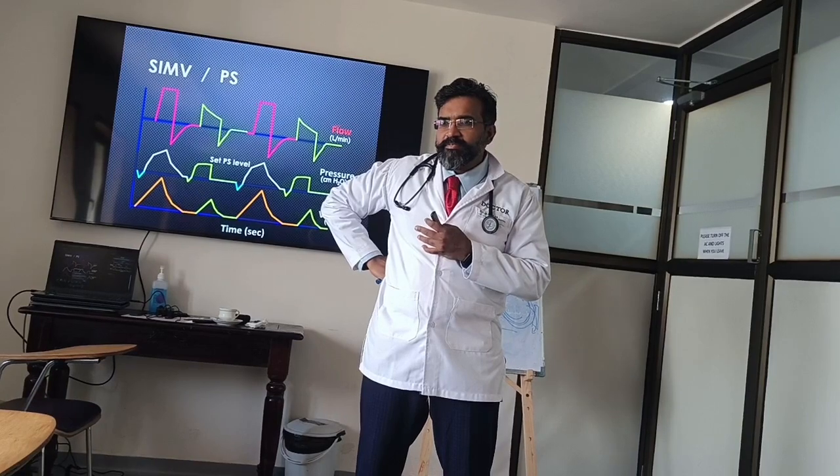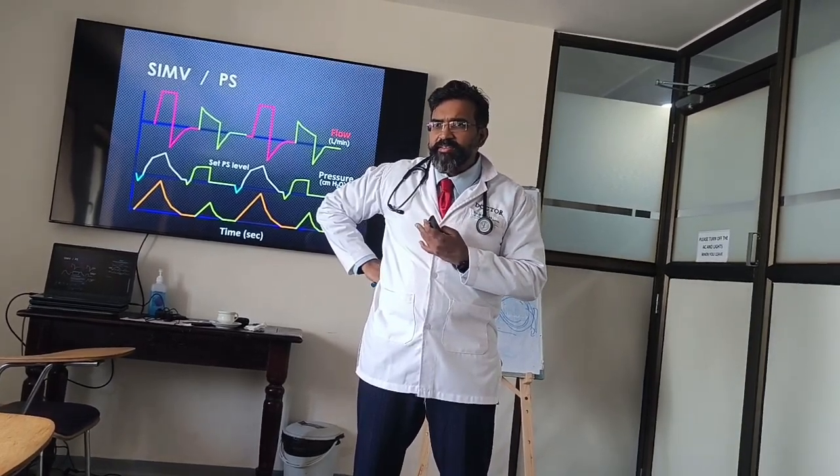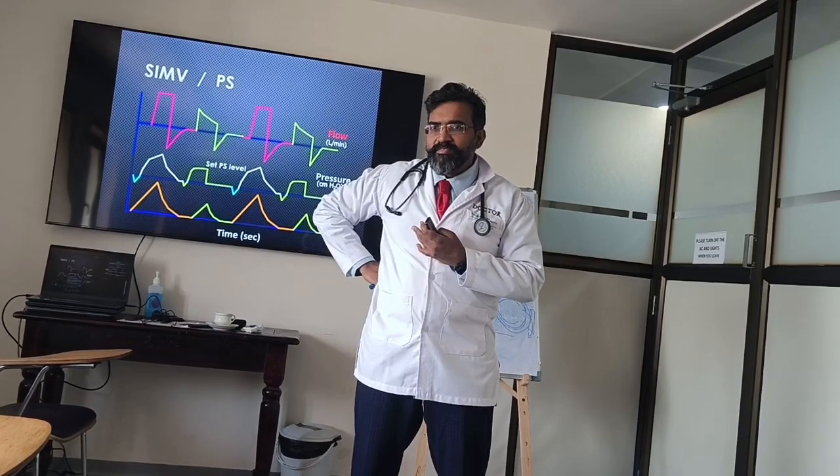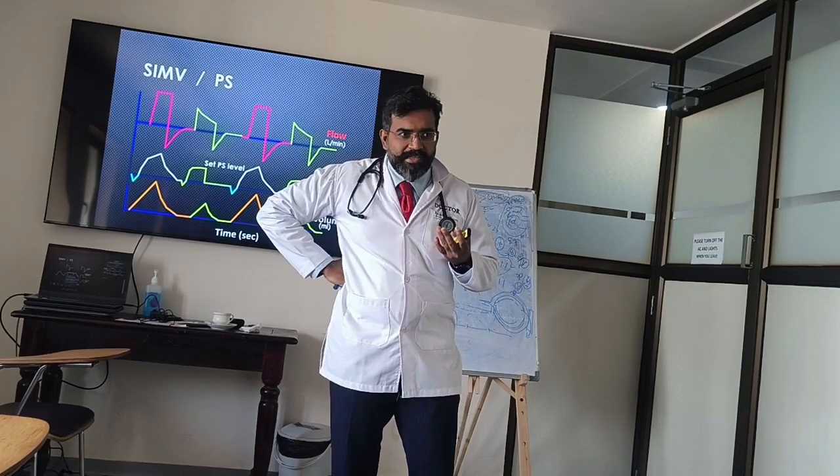Yeah, that has become pressure support, brother, this is a dual mode. Okay, so what will it do in SIMV pressure? It gives a pressure support. It is acting like that only. There's a difference. That's a difference that you must understand.